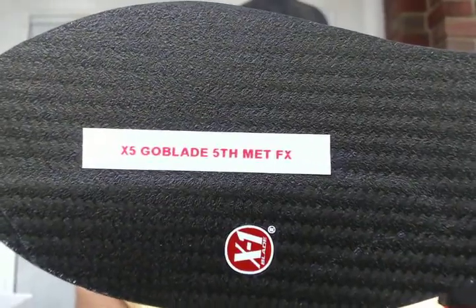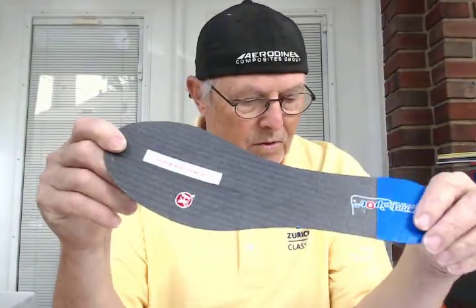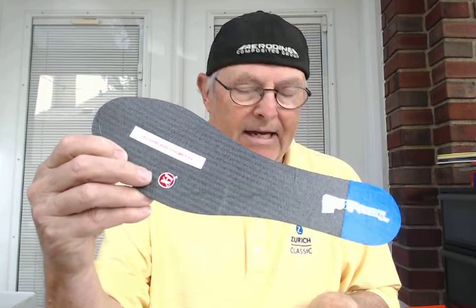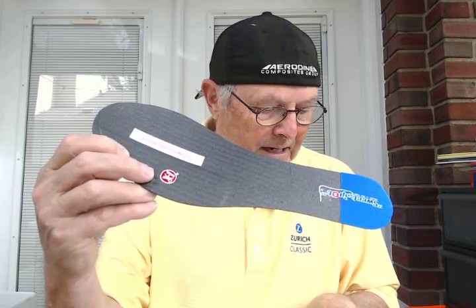It's ClydeIndianaBrace.com. It's the X5 GoBlade for a fifth met fracture. This is going out to Sean in Tucson, Arizona. Sean walks at work 12 hours a day, three times a week. He's an ED nurse. He weighs 305 pounds.